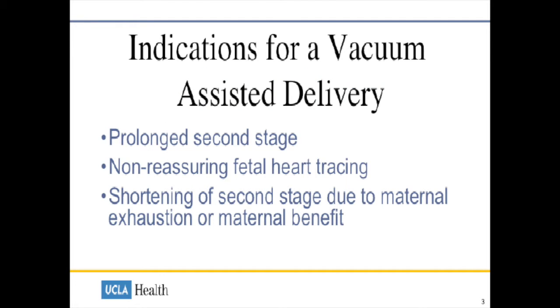There are a number of indications for a vacuum-assisted delivery. These include a prolonged second stage, a non-reassuring fetal heart tracing, and shortening of the second stage due to maternal exhaustion or for maternal benefit, such as in situations of maternal cardiac disorders.